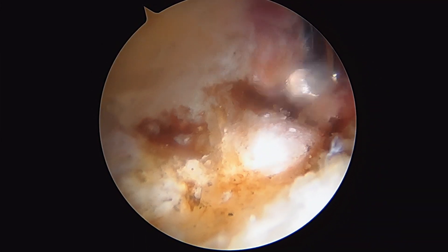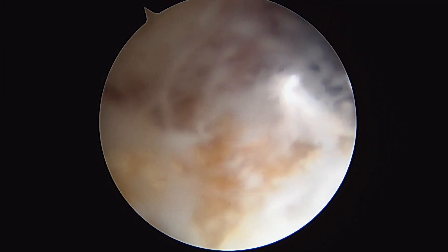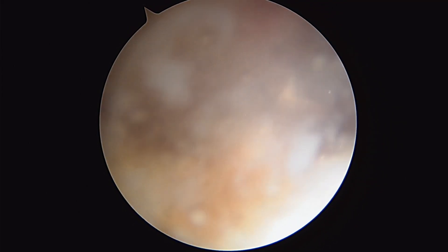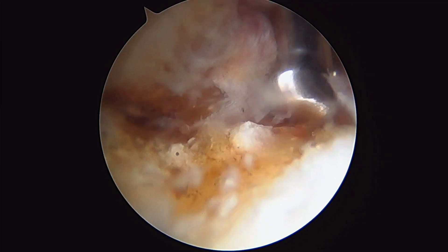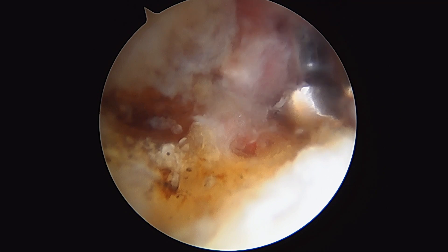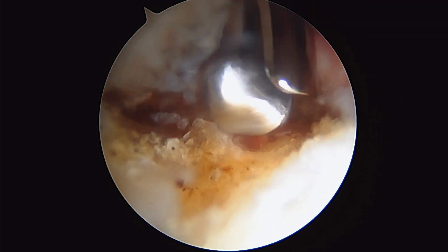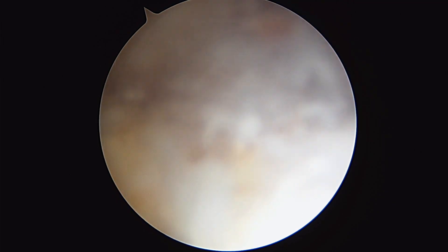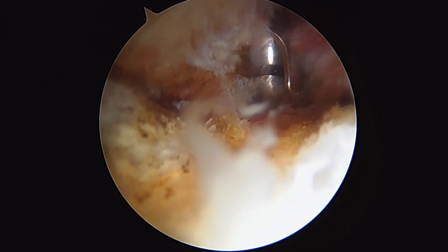I've got my 4.0 burr here. I'm gently going to come along the rim here using suction as we go. This allows us to shave down the abnormal bone and suck it away as we're burring it down. So we're going to restore normal hip architecture here.